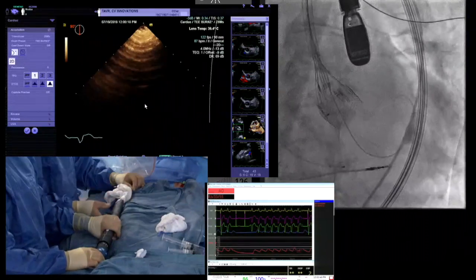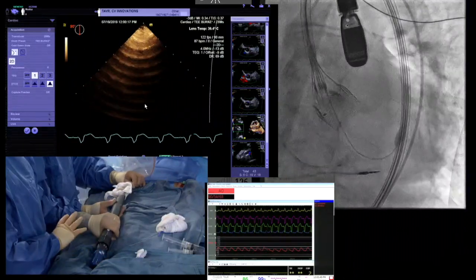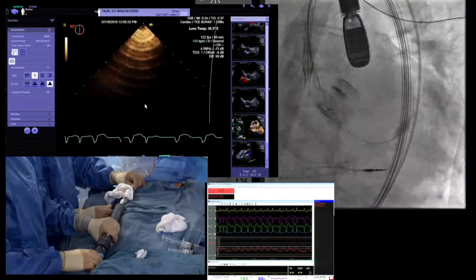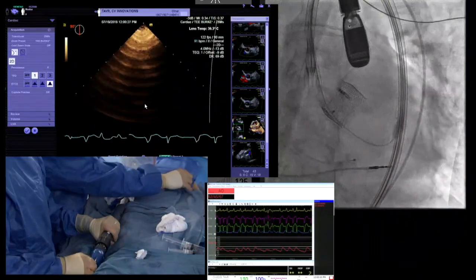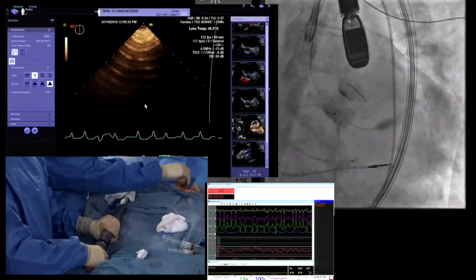So Bob, you want to release this. So we got the sheathing aids. Bob, you want to get the sheathing aids off. So if you look now, the sheathing aids are still attached. And if you look at Bob's movement, just really kind of subtle movement to release the sheathing aids, and voila. Now what we're going to do is pull that wire inside the nose cone as much as possible. And Bob, come back just, you're in perfect position, never mind. Now we got our pigtail caught in that.